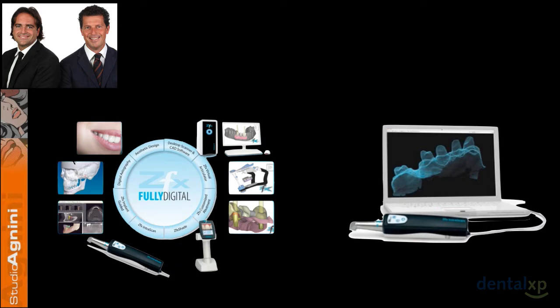As you can see, it's like a computer and a handpiece, so it's really easy to carry between offices, especially if, for example, like us, you have 2 clinics and you have to carry the digital intraoral scanner between the 2 clinics.